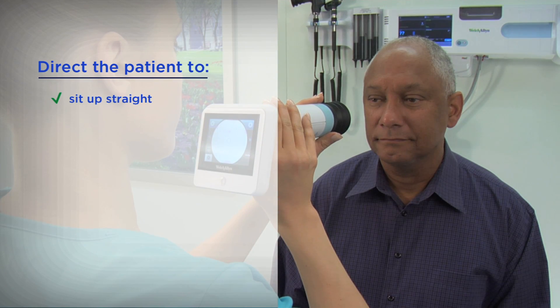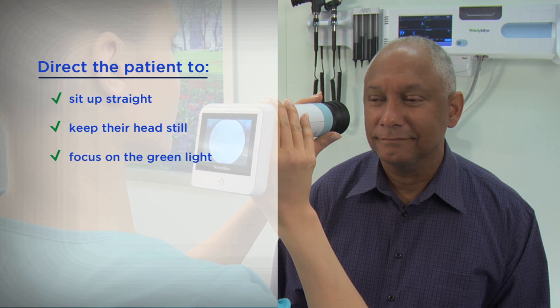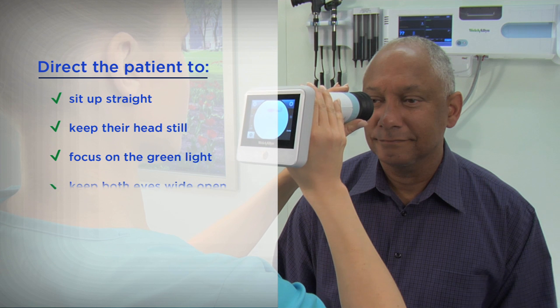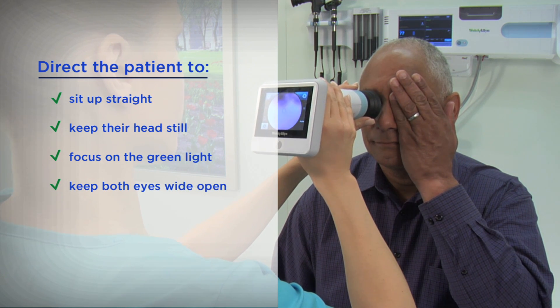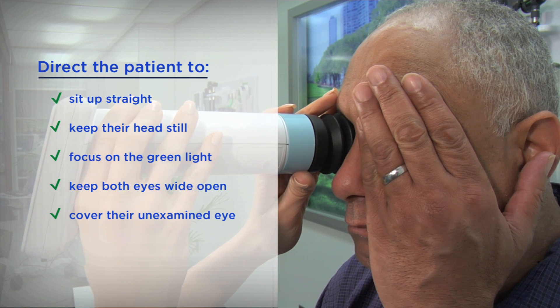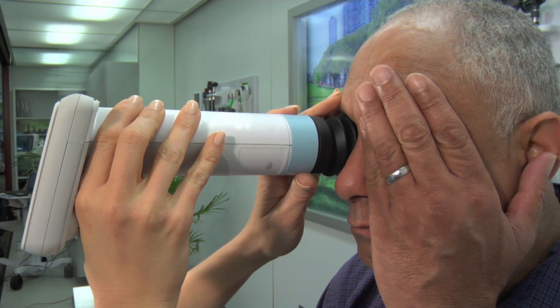Direct the patient to sit up straight, keep their head still, and focus their gaze on the green light inside the RV100. Both eyes should remain open; however, the patient should cover their unexamined eye with their hand. Blinking is permitted, but urge patients to keep both eyes open as wide as possible.